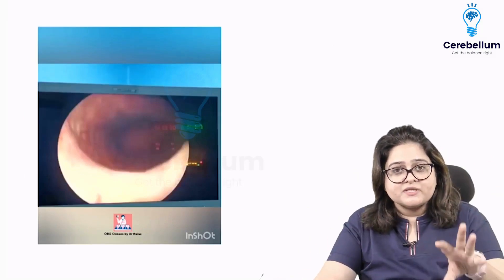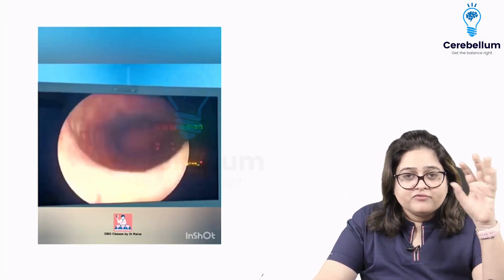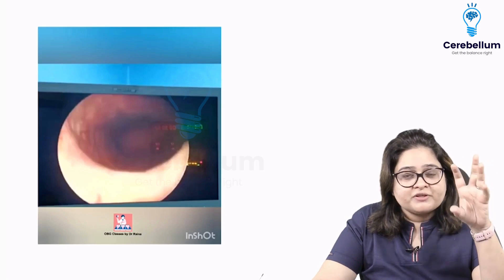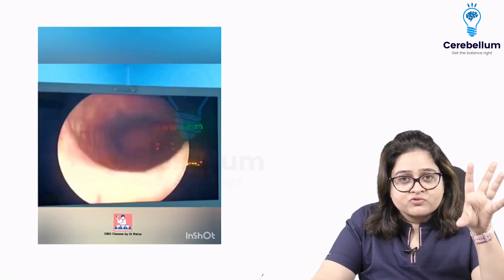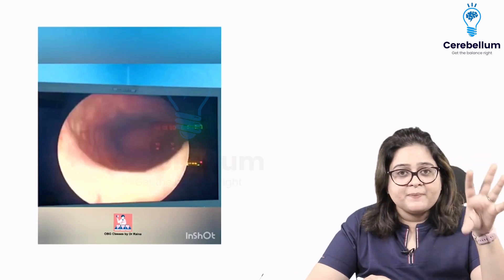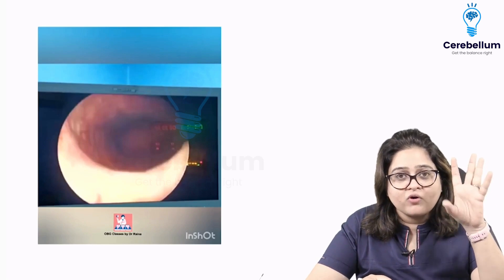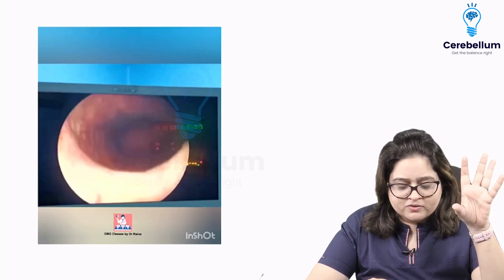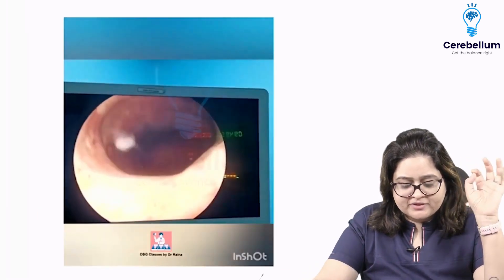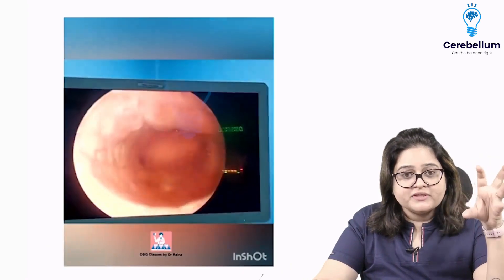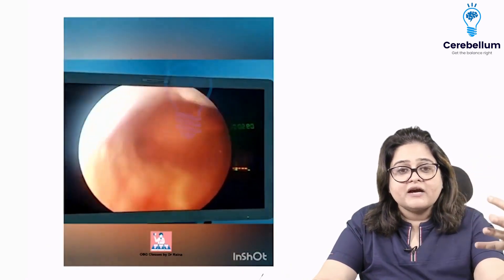Now I'm going to show you some video clips of different diagnostic and operative hysteroscopies. This one is just a simple hysteroscopy of a normal looking uterus. You can see I'm entering — there's fluid inside which is distending the cavity. This is a normal cavity.